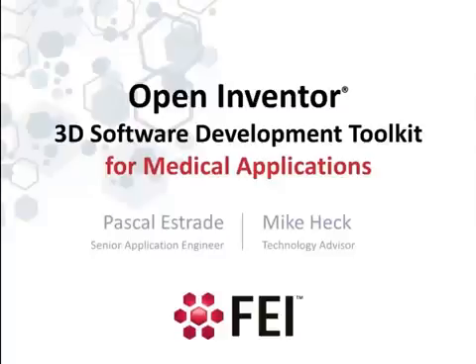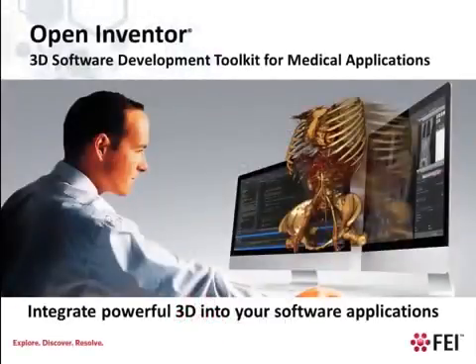Welcome to the webinar, Open Inventor 3D Software Development Toolkit for Medical Applications. This is a short introduction to some of the powerful features that the Open Inventor 3D Toolkit provides for developing both medical and general life science applications. It's not our intent to give a programming course. The overall goal is for you to leave this presentation knowing what the Open Inventor product is, the value it brings in features, productivity, performance, and quality, and how we can help you to create or improve medical visualization programs.